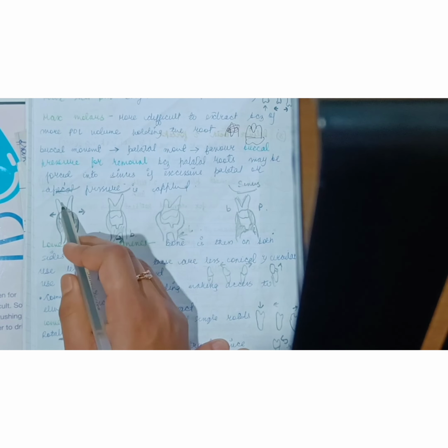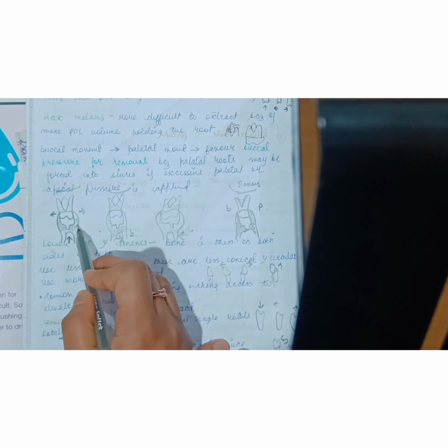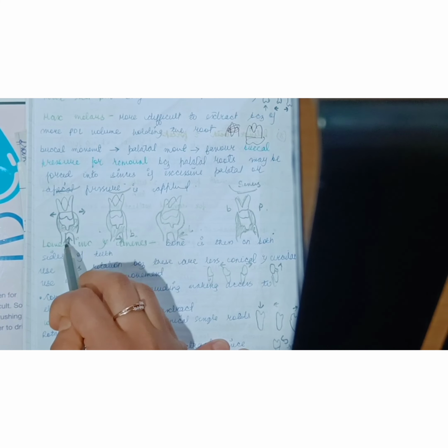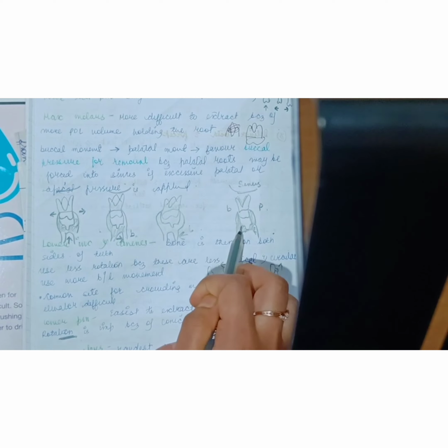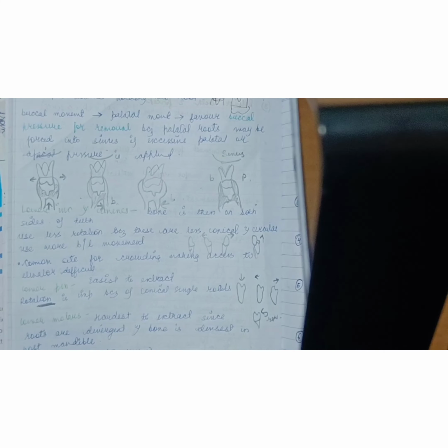So if this is the maxillary molar and these are the forceps, we will apply slight apical pressure, then buccal, then lingual, and then we will deliver the tooth in the buccal direction.